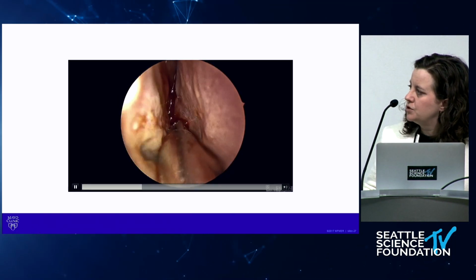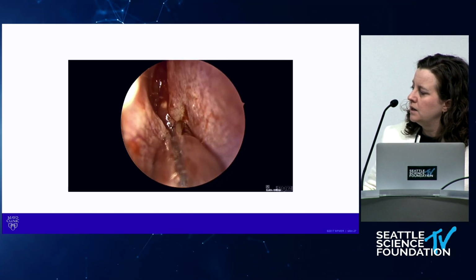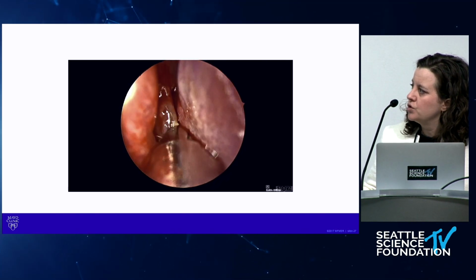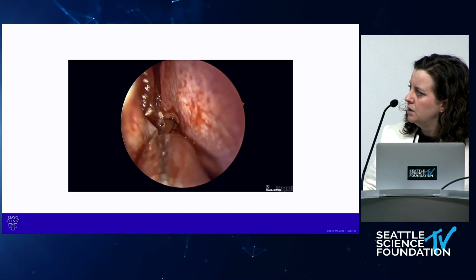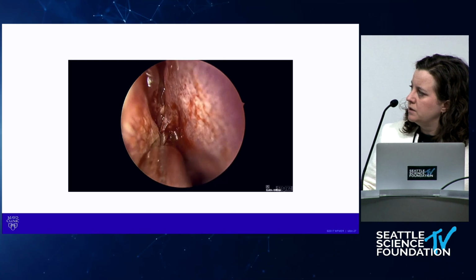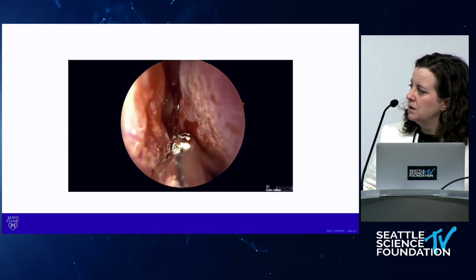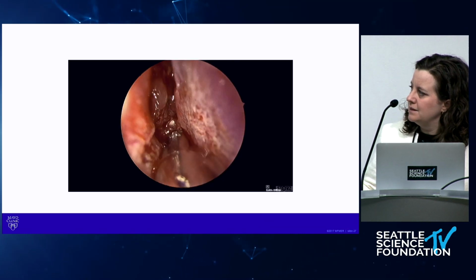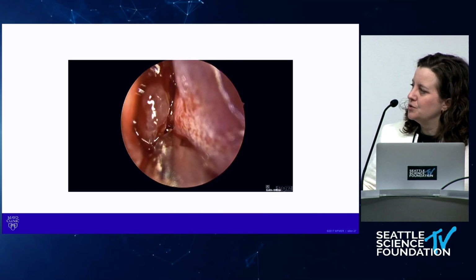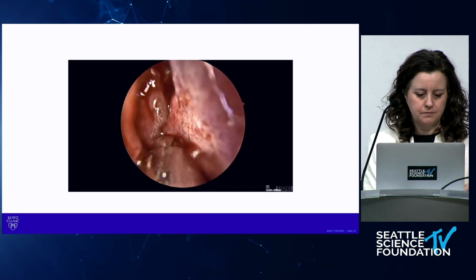And I'm going to trim the superior turbinate and get into the posterior ethmoid and the sphenoethmoid recess transnasal. As we take off the bottom of that superior turbinate, we're going to start to see in that superior meatus the posterior ethmoids. And the residents need this technique also when we're doing pituitaries. We go transnasal, trim that superior turbinate, find your sphenoid.